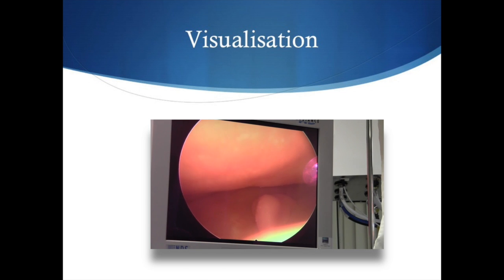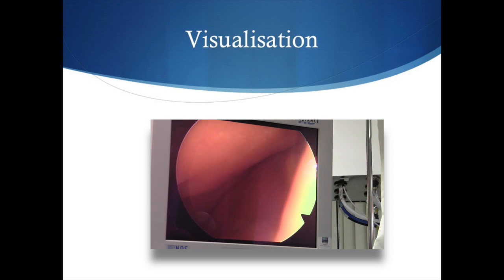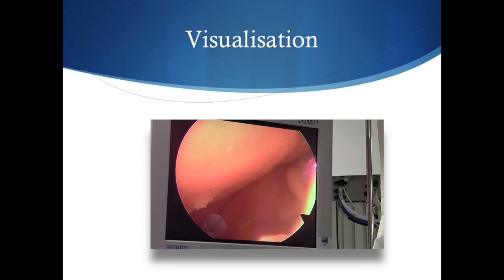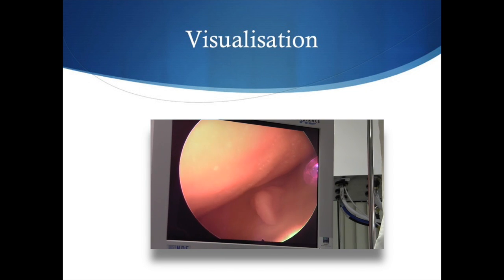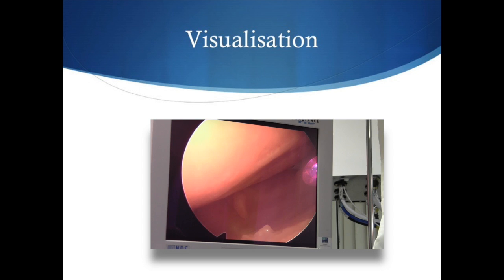Here we have recreated a fundal polyp. The endometrium and the endocervical canal should also be assessed while the hysteroscope is being slowly withdrawn.